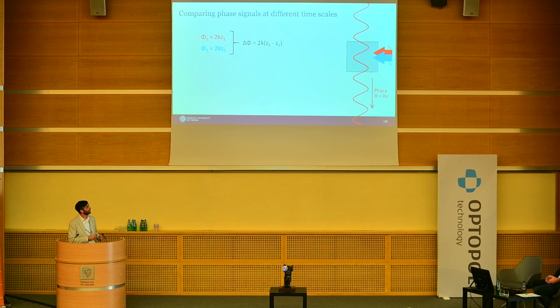We can now take this and turn it around. We know that velocity is position change over time. Then we can just fill in this over here, convert wave number to wavelength, and we end up with velocity then equals something that's proportional to the phase difference, and wavelength here, indirectly proportional to refractive index, and indirectly proportional to the time elapsing between the 2 acquisitions. Yeah? The time between T1 and T2, that's tau over here. So by measuring the phase difference, we can convert this into a velocity in beam direction.